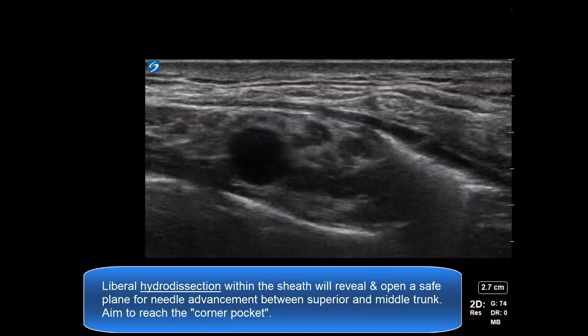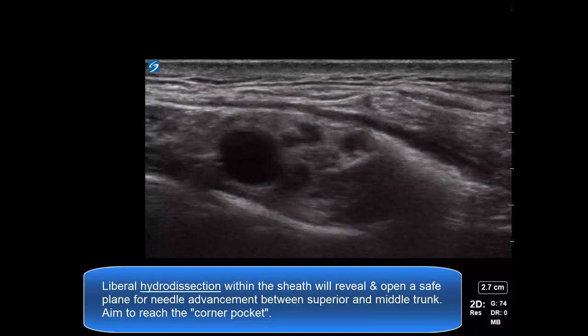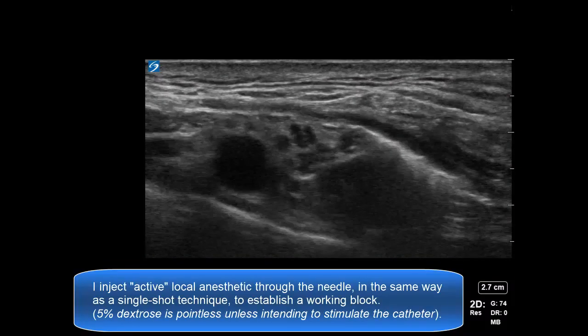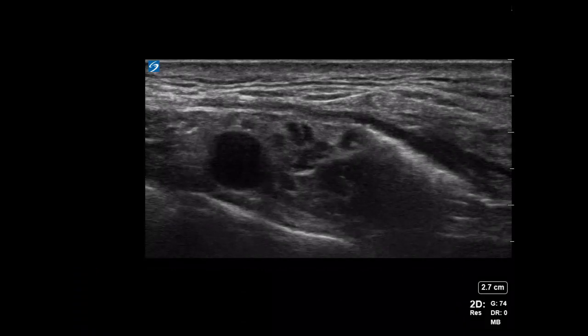Again, we're aiming to reach the corner pocket between the artery and the first rib. During this process, I'm injecting local anesthetic through the needle in the same way that I would do a single shot supraclavicular block.